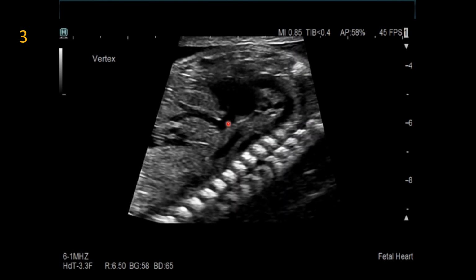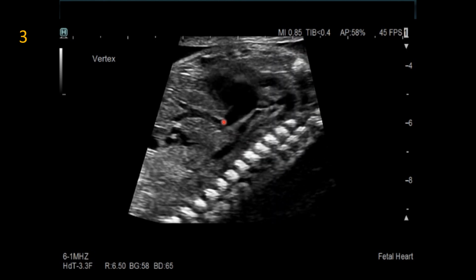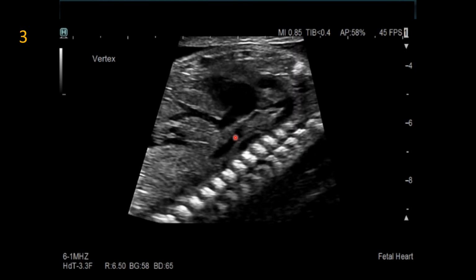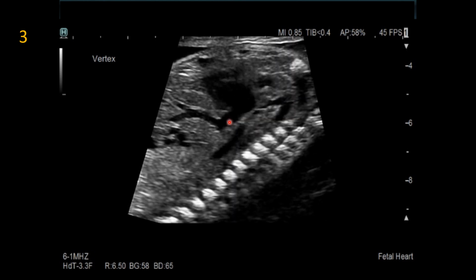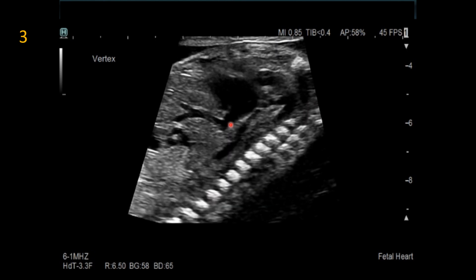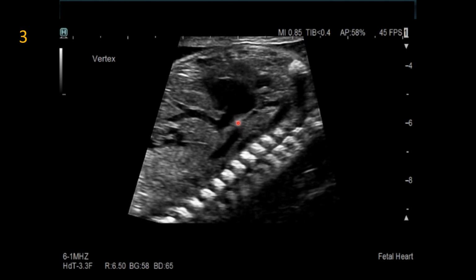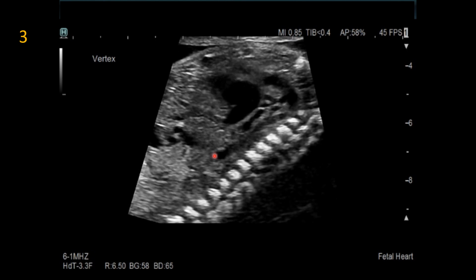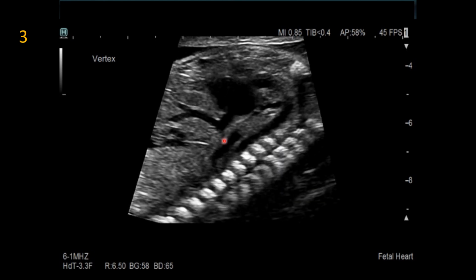And that, if you remember that axial view through that upper abdomen, we saw the aorta on the spine, we saw another circular venous structure anterior to the aorta, and then we saw the IVC anterior to that. And so the IVC is out of plane here, but you'll see that it's continuous, and it connects to that common atrium with this vertical vein passing behind that IVC.